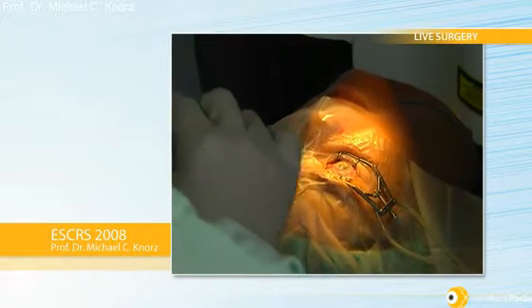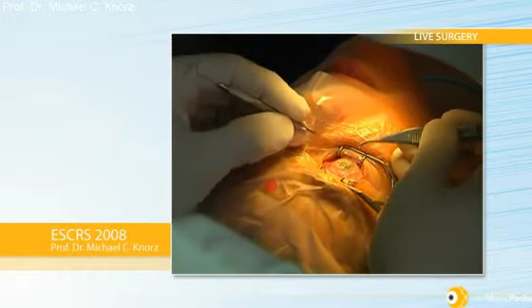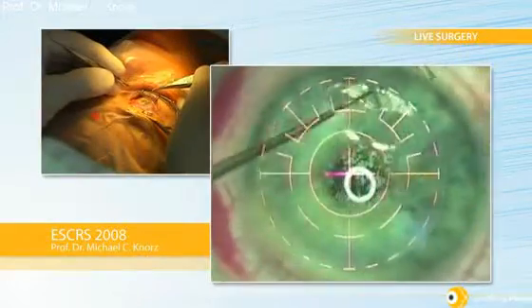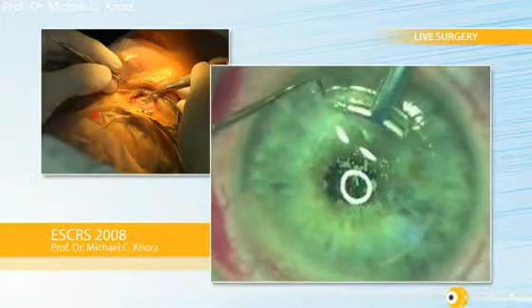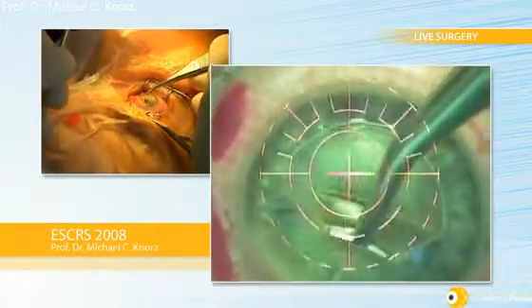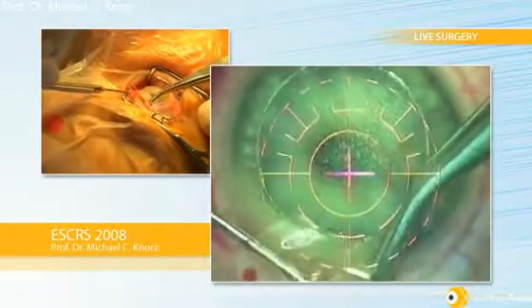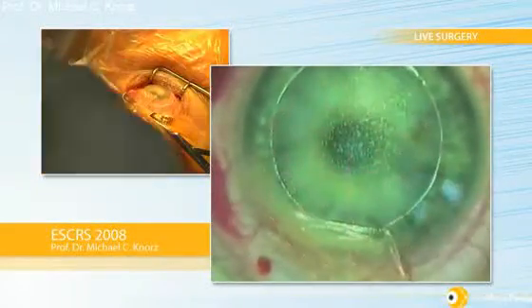This is beautiful because we have only very light OBLs as you would expect. Once I lift the flap they will immediately disappear. I like a bimanual technique for the lift. I open the edge at the 6 o'clock position — you can see how easily this is done even with the 150 degree inverted side cut. I use special forceps and just gently pull the flap upwards, then fold it upon itself using the side of the spatula to avoid any drying of the flap during the ablation procedure.